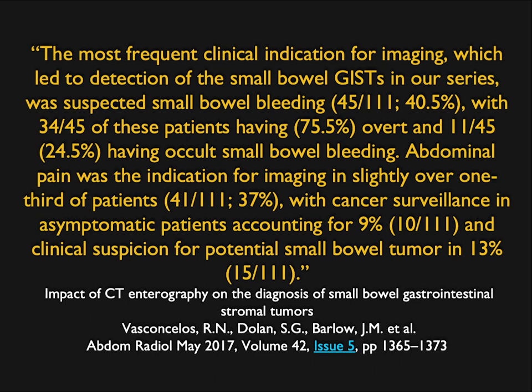FDG PET can increase the accuracy of the RECIST criteria. So again, one of the things that happens with immunotherapy in general is sometimes tumors become very necrotic, and so they begin to look bigger before they look smaller. And so at times you might say, oh my God, that patient's progressing on therapy, but it's just simply a good response, and so you don't want to be telling the referring docs the wrong thing.